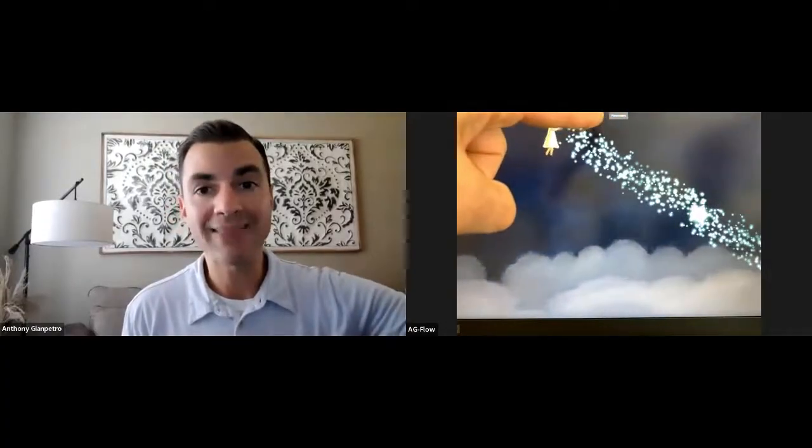So I think that was long enough to give you some ideas. Really quick though, what I love about this activity is notice the parameter button at the top of the screen. If you find immediately like, oh no, the ratio that I guessed of 3 seconds in to 6 seconds out isn't good enough for Anthony, what he's doing right now, hit parameters and you'll notice that you can adjust them during the activity.